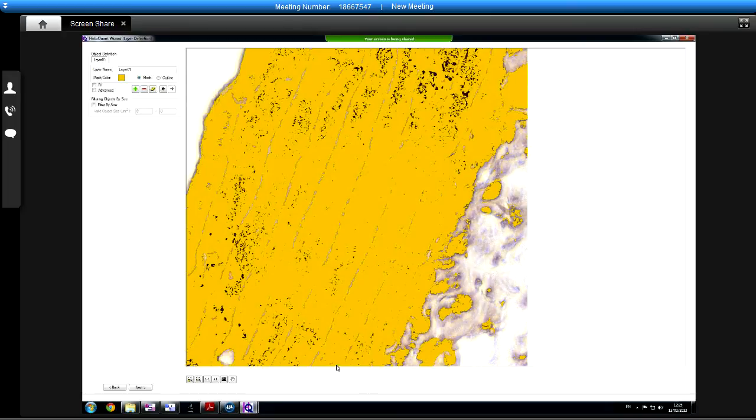All you're interested in is total area, mask area, and what percentage that is in the whole thing. That's what we've done.